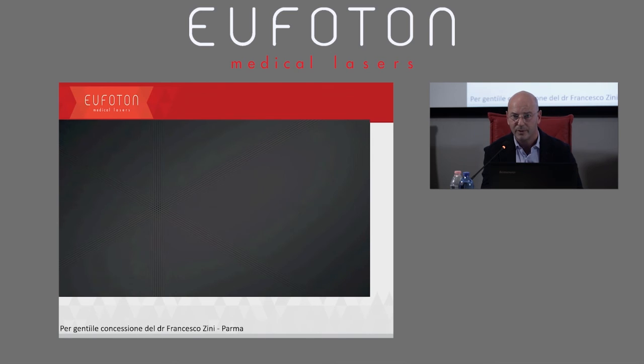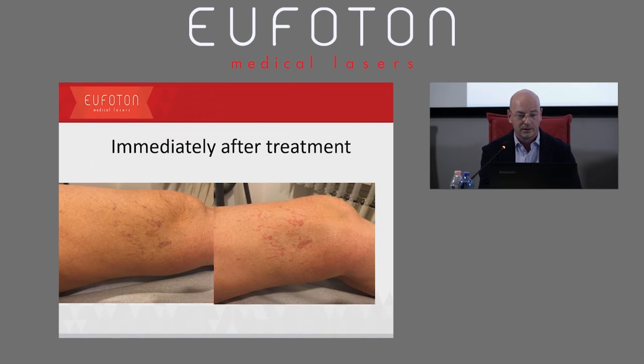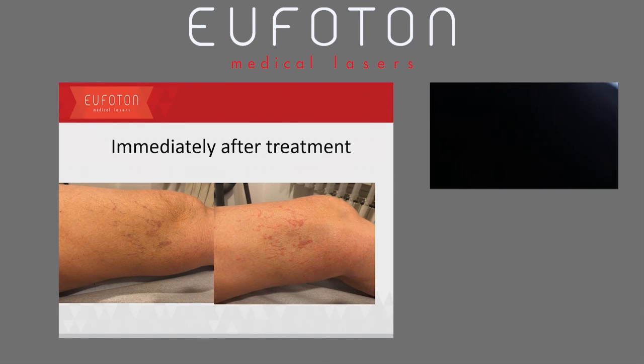So this is what happens with treatment. So the spider veins are completely erased. The patients are given goggles, as I said before, and they look at it and they say, wow, it's really like an eraser.